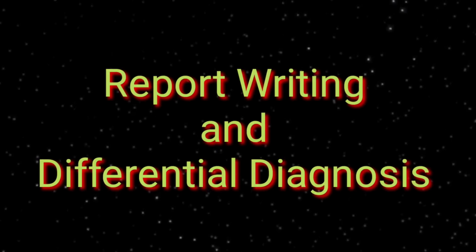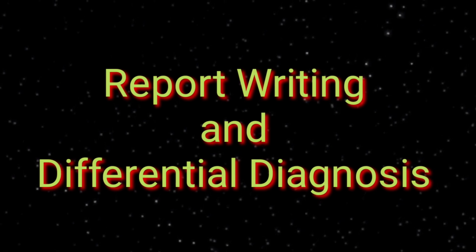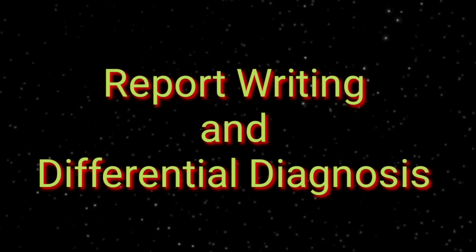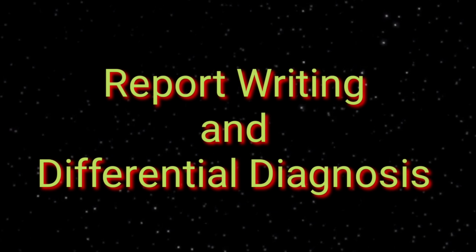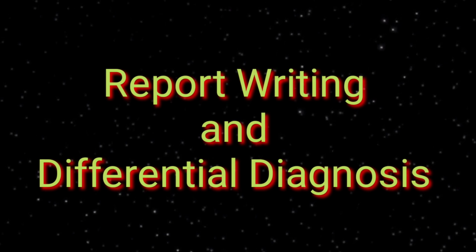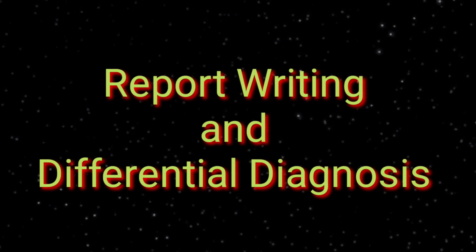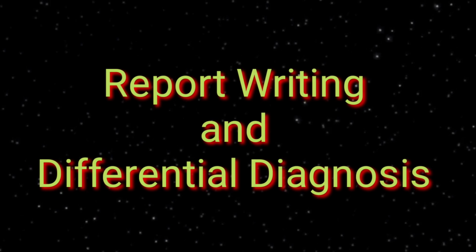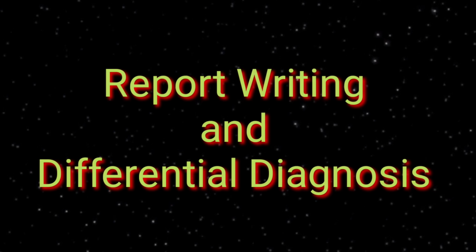Report writing and differential diagnosis is really an art. You have to be very smart while you are writing your report, and all the information which you appreciate on the ultrasound screen should be pinned down and should be in your report. You have to mention and explain its echogenicity, its hilar echogenicity, its cortical echogenicity, its outline, its abnormal or irregular shape, and its multiplicity. All of it should be in your report.